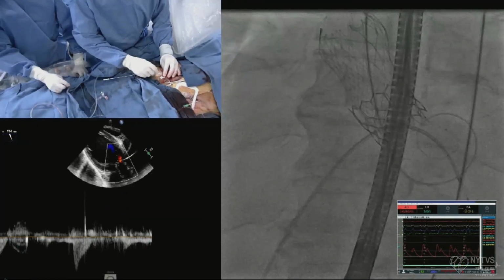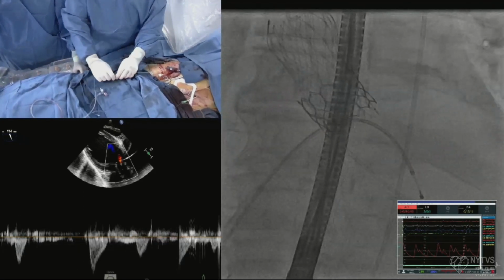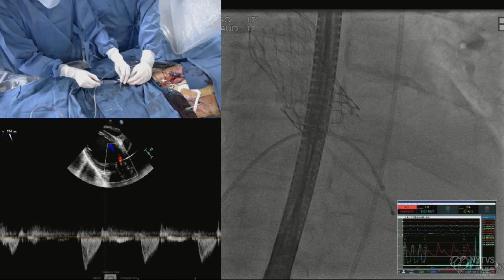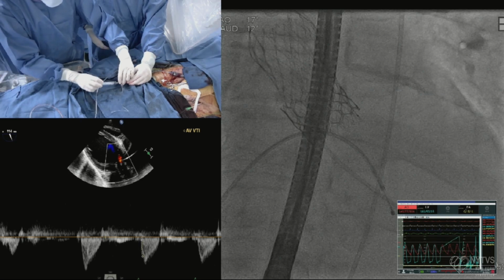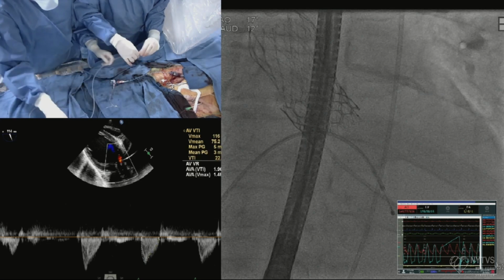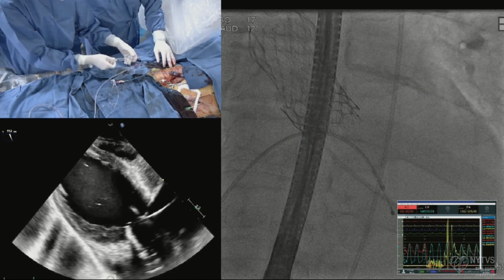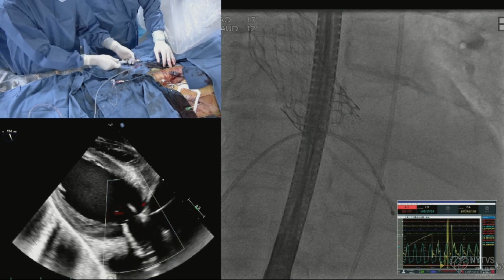Again, very patient-specific decision-making. And Tarun, to your point, I think you also need to individualize the patient's need. And I think that's why Hassan Jalhawi, your partner, is a believer of getting the pre-index TAVR CT. Look at the lay of the land, because we all know anecdotally that patients have ruptured because they were too aggressive with the pre-dilation to put the second balloon-expandable valve. So to your point, you need to look at the patients across time to really understand the anatomy before just blanket saying we would do it the same way for every patient.